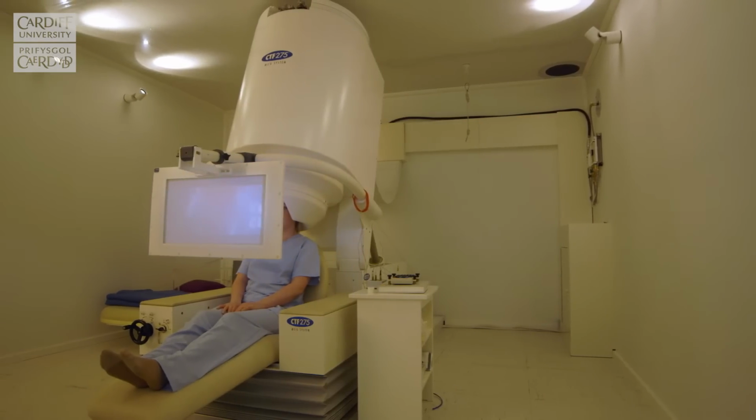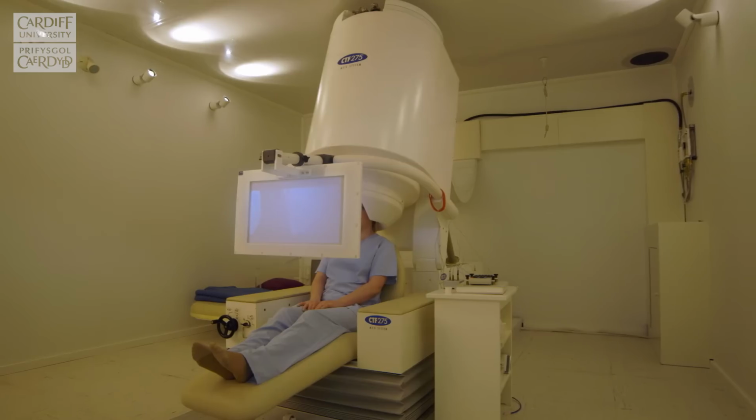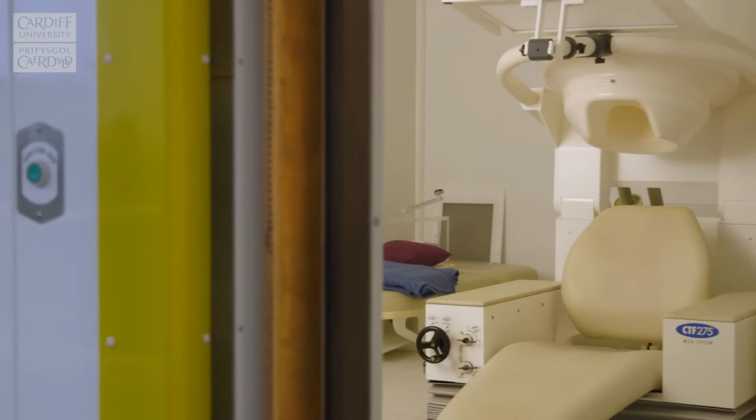So MEG is better at localizing activity compared to EEG and produces less noisy data. The major downside of MEG relative to EEG is the size and cost of the equipment involved, although more portable versions of MEG are currently being developed. Compared to fMRI, MEG has much better temporal resolution but poorer spatial resolution.